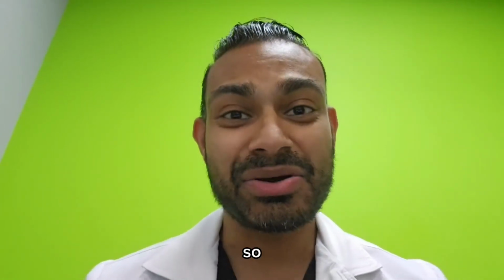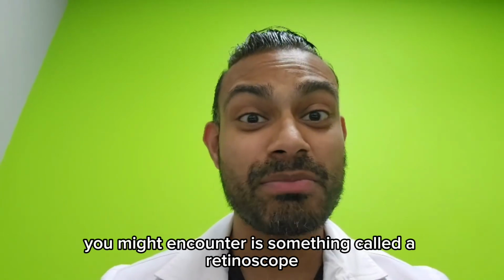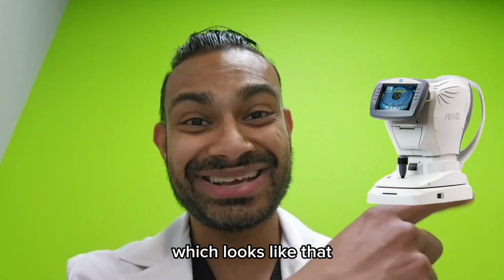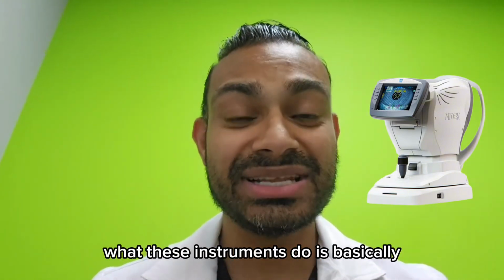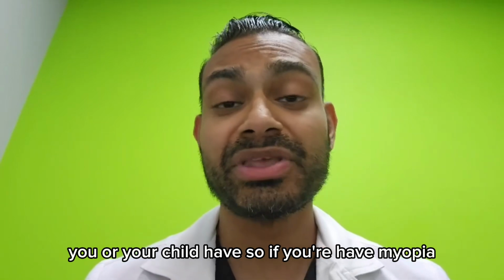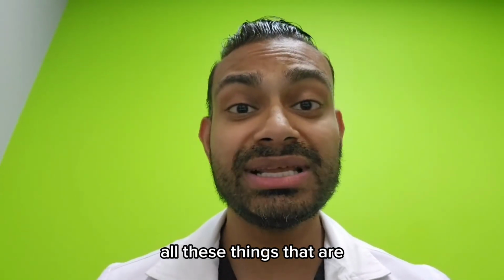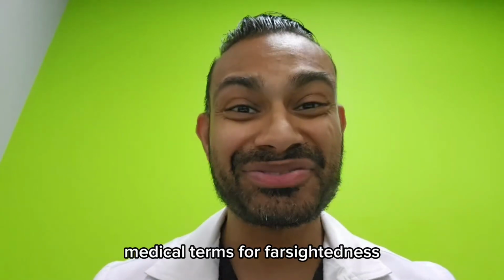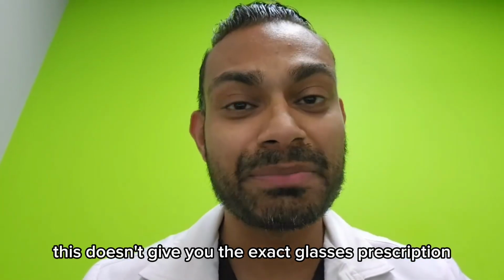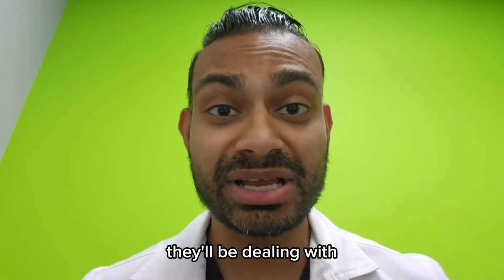So, one of the instruments you might encounter is something called a retinoscope, which looks like this, or an autorefractor, which looks like that. What these instruments do is basically tell the type of refractive error you or your child have. So if you have myopia, hyperopia, or astigmatism, all these medical terms for farsightedness or nearsightedness. This doesn't give you the exact glasses prescription, but it gives the doctor an idea of the type of refractive error they'll be dealing with.